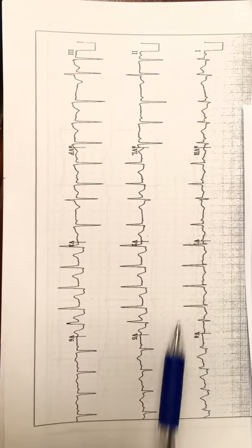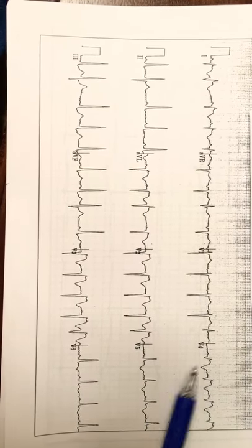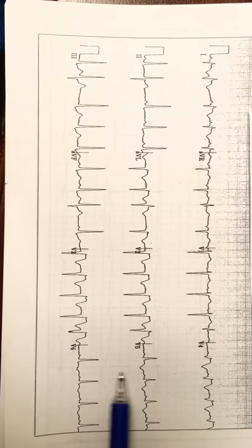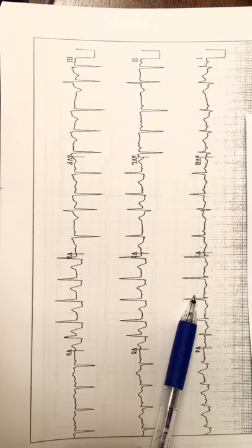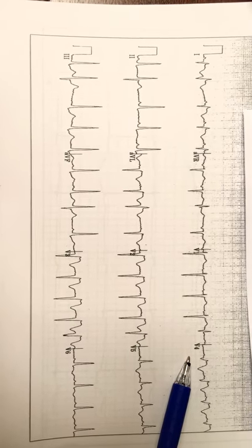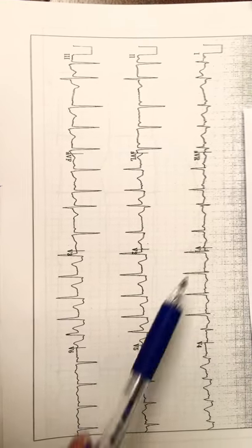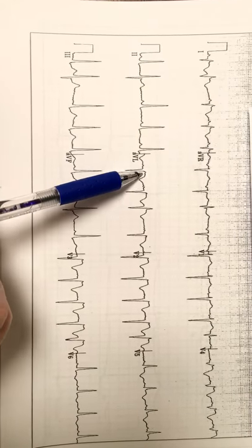What you would normally see is some reciprocal changes, but there's really no ST depression. What you do see is some inverted T waves in V5 and V6, which are fed by the circumflex. V1, V2, V3, and V4 are fed by the LAD. What is also concerning for the circumflex is you have ST elevation in lead 1 and AVL.